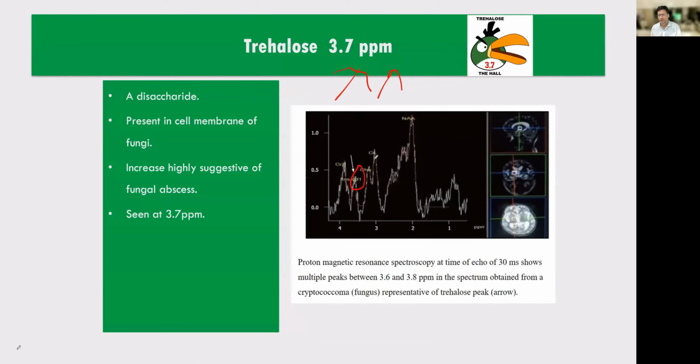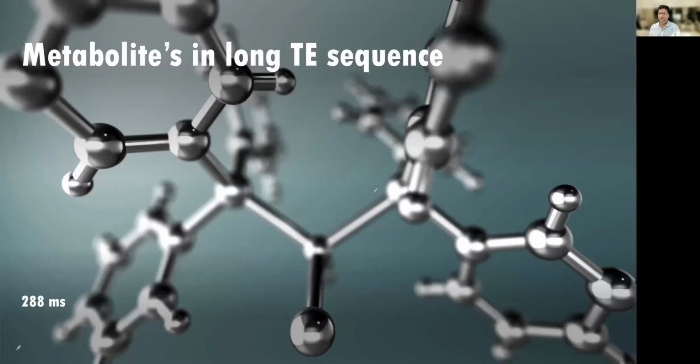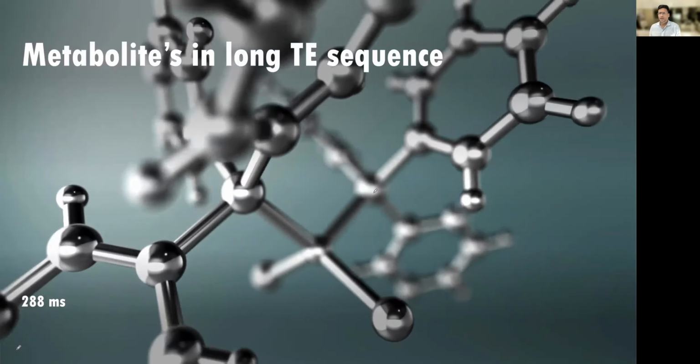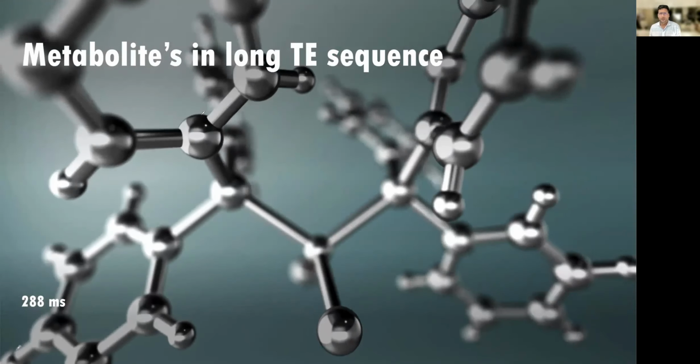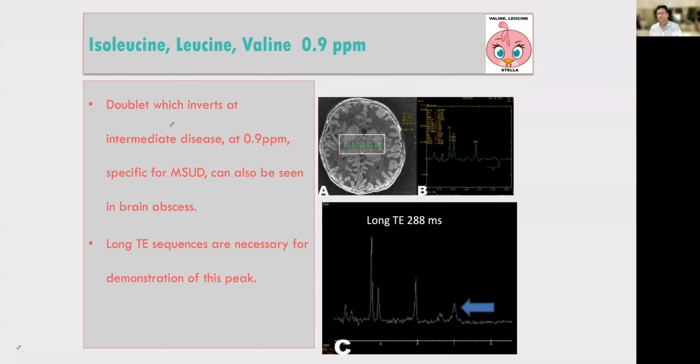Most of these trehalose peaks have been diagnosed and published from Indian data only. Ultimately, long TE sequences are being used for certain, and this is one of my prized possessions and one of the beautiful cases which I have diagnosed personally.